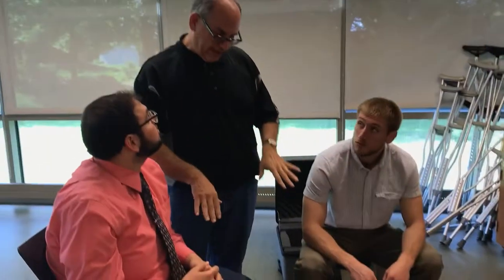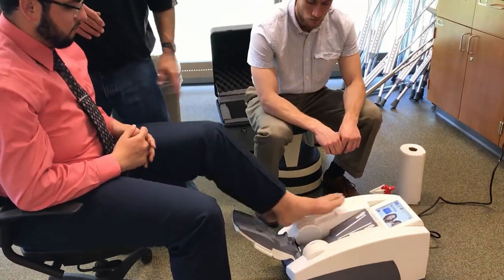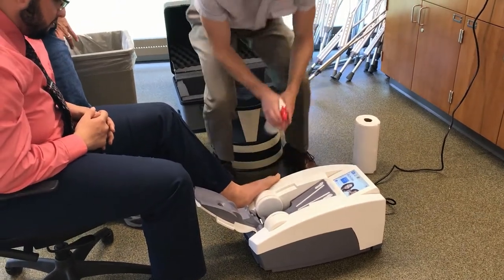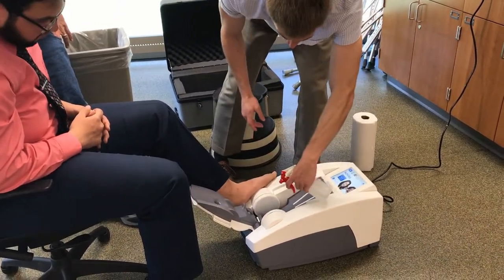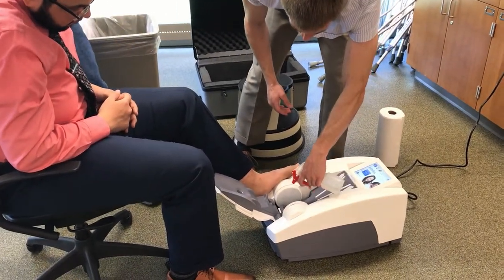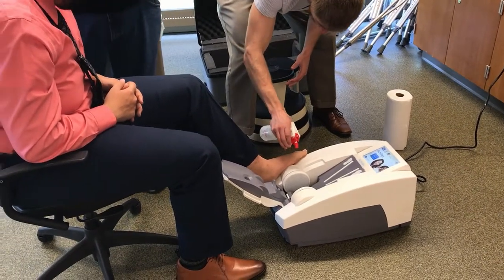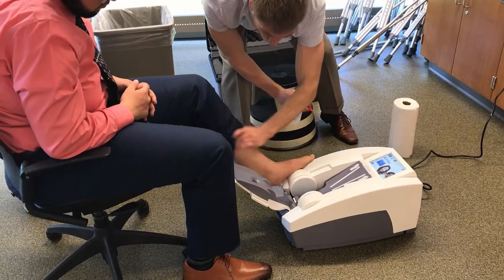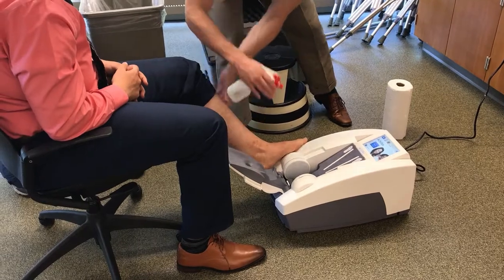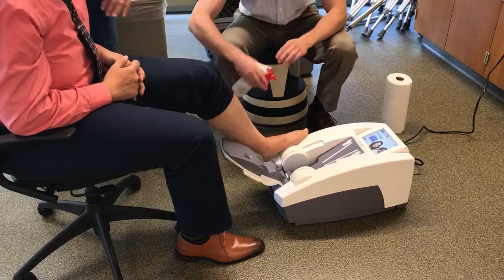One thing we should have done before that — so we'll get a chance to see it again — is have our patient take their foot out and set it like it was, because we absolutely want to spray the membranes with lots of alcohol. Once you spray their ankle, it may be better to spray the membranes on both sides first, although it doesn't really matter. Just make sure there's lots of alcohol in the membranes and lots of alcohol on the patient's ankle. Do a quick spray on the ankle, then put your foot back in like it was.